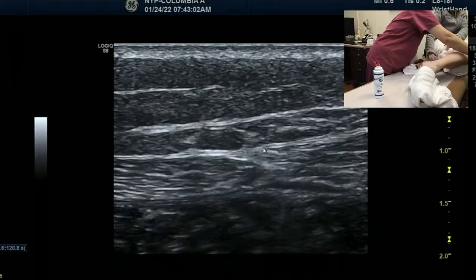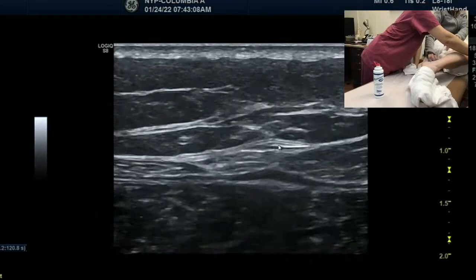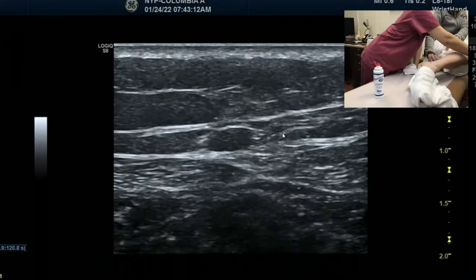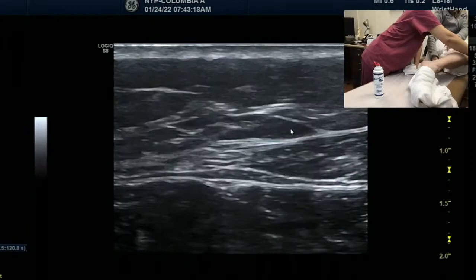You can see the gastroc starting to pop out too. So here, this one. Now I'm going to go down. See, that's here. Going down. Coming up. Two splitting to one, two, one, two. Very clearly, I saw it. Just try to bring it in the middle of the screen.